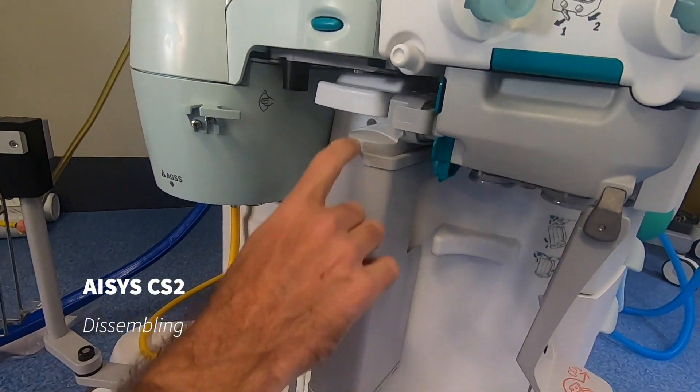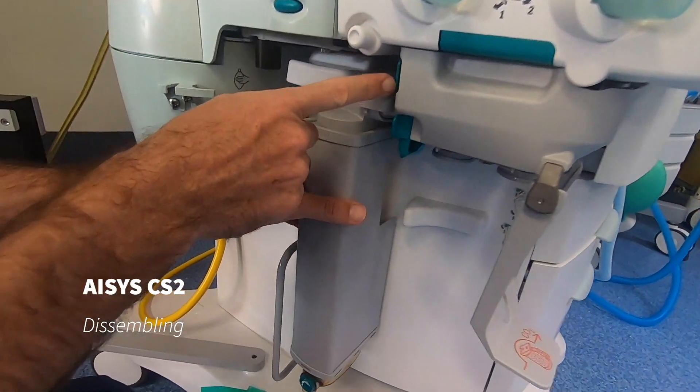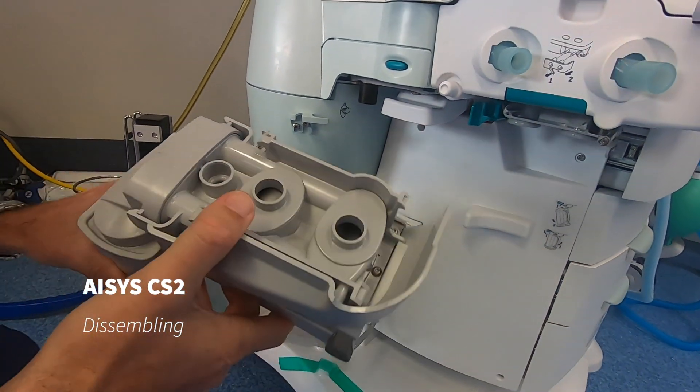Next, we can remove our condenser, our water trap assembly here. There's a green lever up under here that moves towards the back of the machine, and that's removed. We'll put that aside.